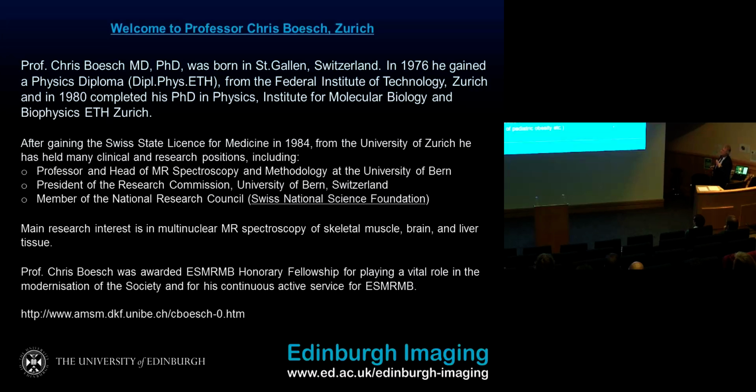As soon as we are looking at it repeatedly, and in healthy subjects, MR can contribute a lot. It has various modalities which can be used, mainly based on the chemical shift dispersion, as for example CEST and hyperpolarized. PET and SPECT are much more sensitive, and I'm usually very jealous after a lecture by PET people, because this sensitivity we never can have with MR spectroscopy.